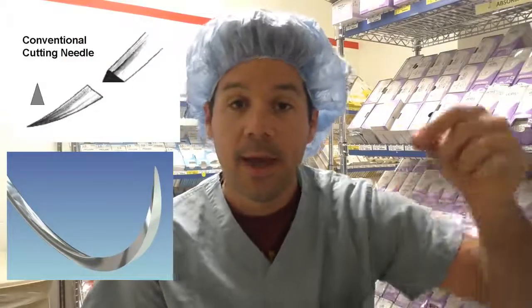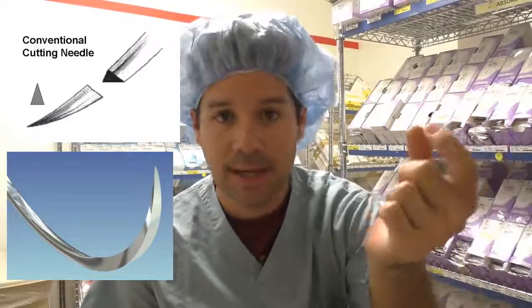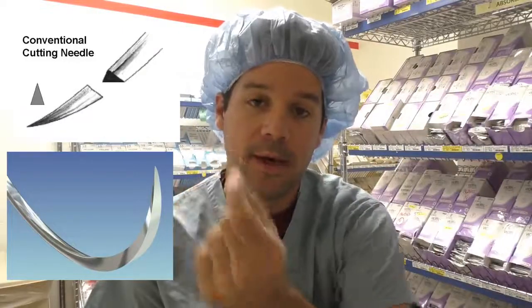When it comes to cutting needles, obviously, it sounds like it cuts, because it does. It has a sharp tip, and as the needle goes back off of the tip, it's actually bladed as it goes down the needle. And that's used for cutting into tissue that is really, really tough. If you're out in the field, you'll recognize the 4-0 Monocryl PS2. That PS2 is a reverse cutting needle, and it's used for closing the skin.